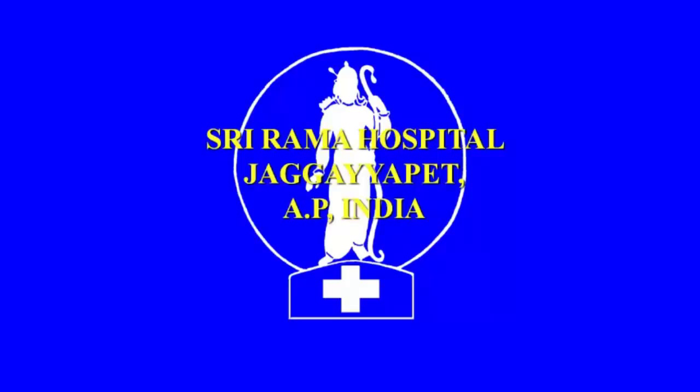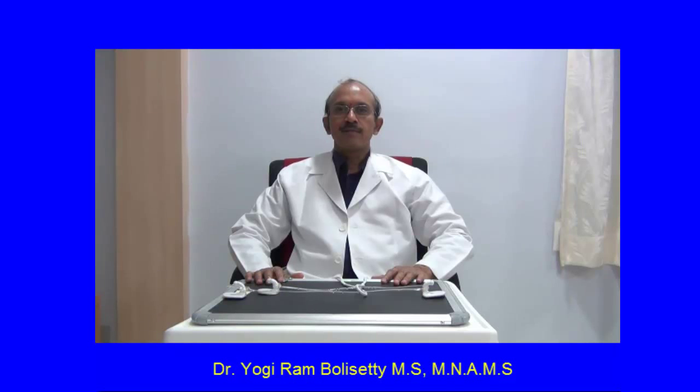Greetings to you from Srirama Hospital, JagayPet, Andhra Pradesh. Hello, I am Dr. Yogiram Bursati from Srirama Hospital, JagayPet. Now I will demonstrate to you the method of making single hand knotting. I will demonstrate the materials required and the technique of making the reef knot with the hand, then with the instruments, and later to make a knot in a difficult situation like in a cavity.